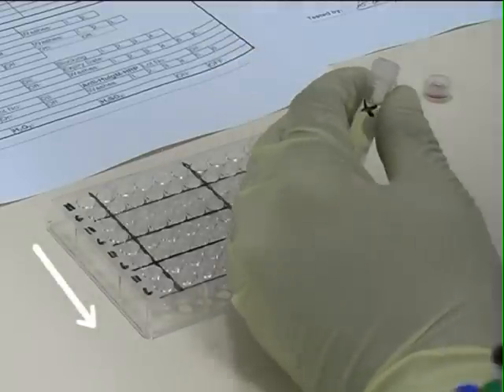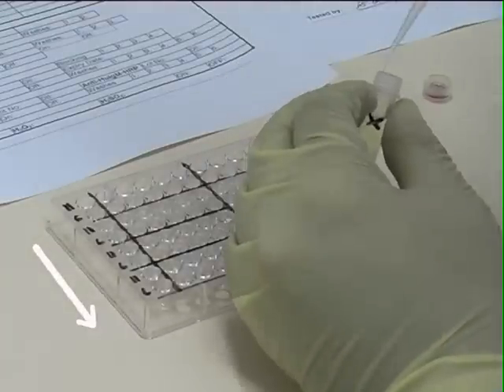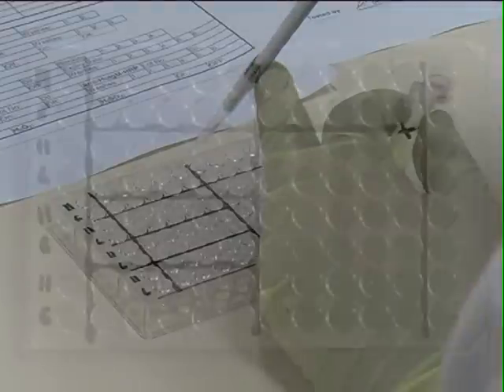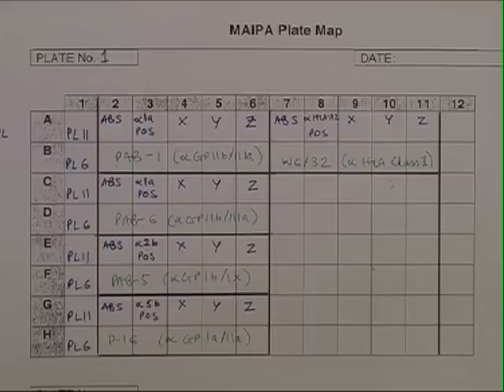And the controls and patient sera, or plasma, are added down the plate like this. We have a reagent blank in the first column, then a negative control, followed by various positive controls depending on the glycoprotein, and then the patient samples. In this case, we have called them samples X, Y and Z.